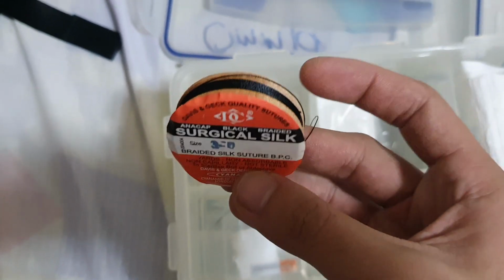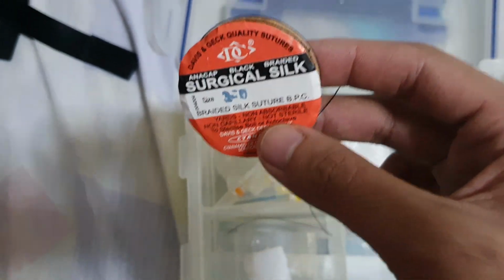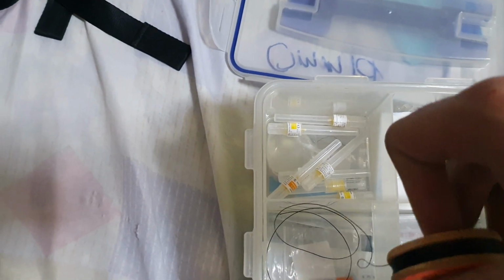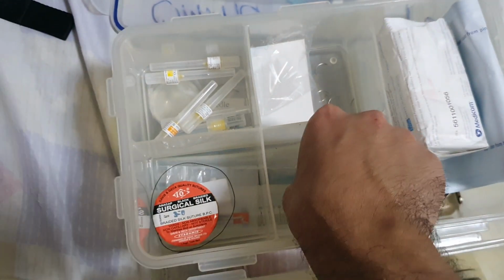This is non-resorbable, which means that after extraction, we need to suture it, and after 1 week of the extraction, you need to go back to the dentist to have this one removed. This one, the suturing thread, and of course the lidocaine.